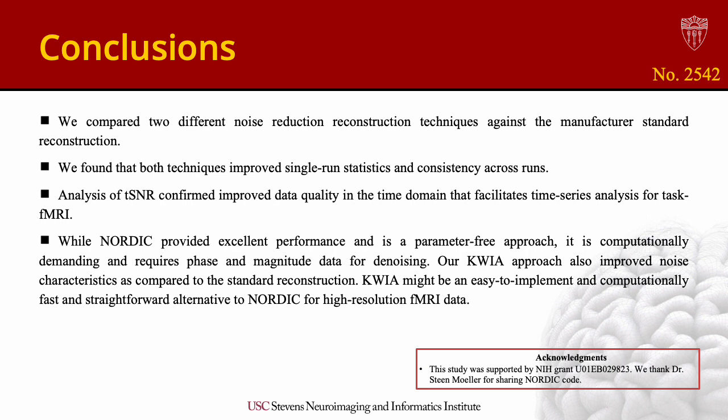While NORDIC provided excellent performance and is a parameter-free approach, it is computationally demanding and requires phase and magnitude data for denoising. Our KWIA approach also improved noise characteristics as compared to the standard reconstruction. KWIA might be an easy to implement, computationally fast, and straightforward alternative to NORDIC for high-resolution fMRI data.